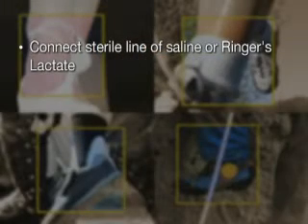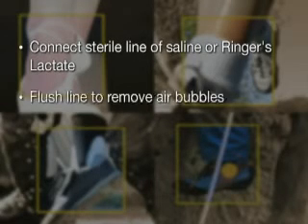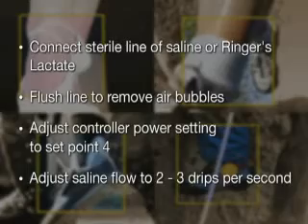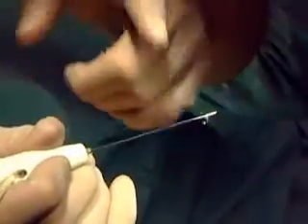After the device is connected to the sterile line providing saline or Ringer's lactate, flush the line to remove all air bubbles. Adjust the power setting on the controller to set point 4. Adjust the saline flow to 2 or 3 drips per second.